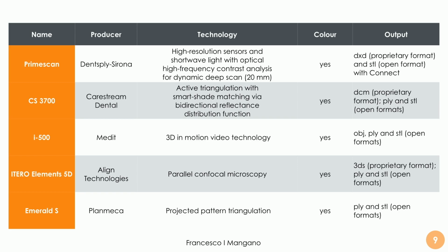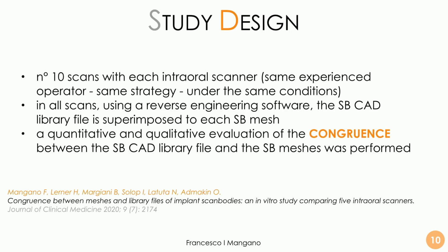It means different interpolation methods, and everything changes because we can have really different results from different scanners, and nobody really investigated this topic in depth, so it's really something important. So 10 scans with each intraoral scanner, same experienced operator, same strategy, under the same conditions of temperature and humidity.